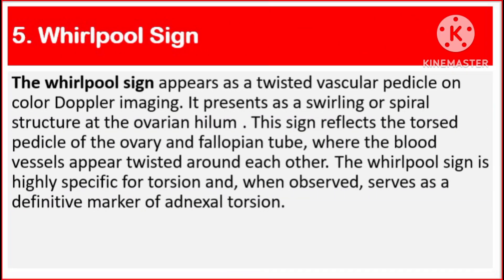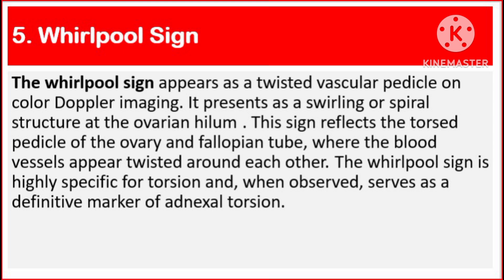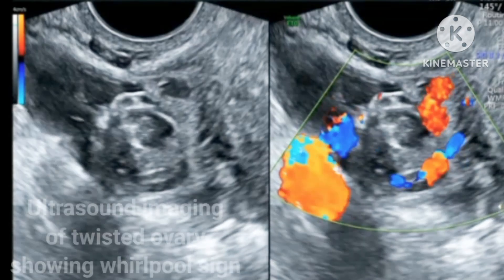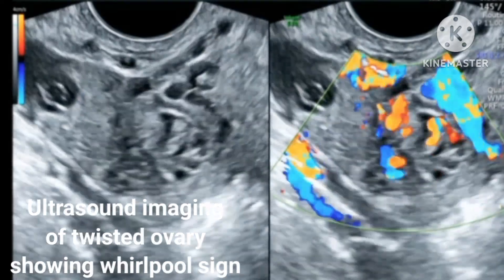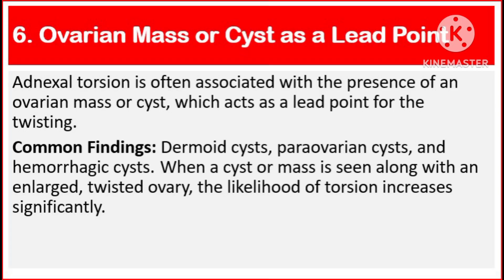Number 5: Whirlpool sign. The whirlpool sign appears as a twisted vascular pedicle on color Doppler imaging. It presents as a swirling or spiral structure at the ovarian hilum. This sign reflects the torsed pedicle of the ovary and fallopian tube, where blood vessels appear twisted around each other. The whirlpool sign is highly specific for torsion and when observed serves as a definitive marker of adnexal torsion.